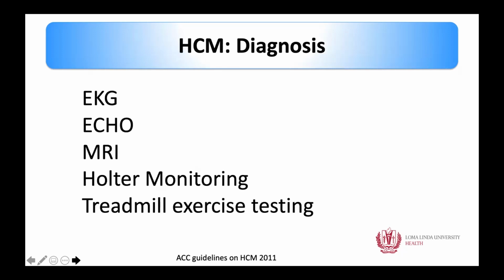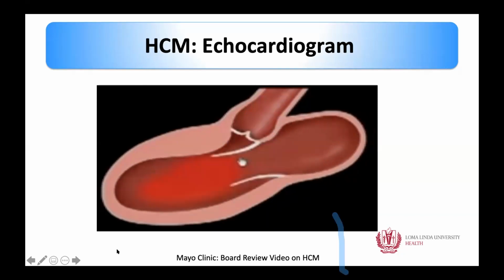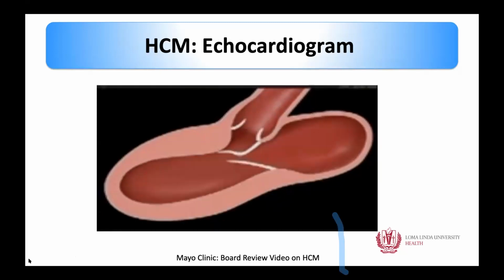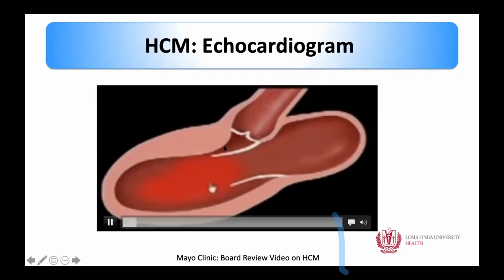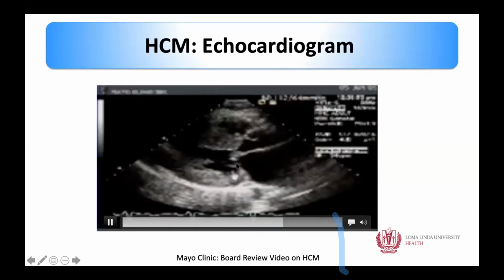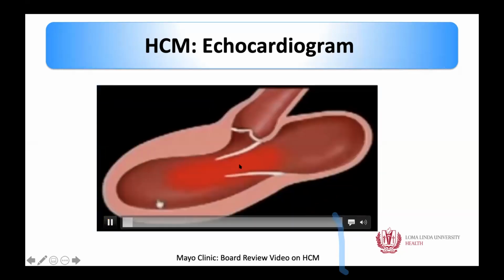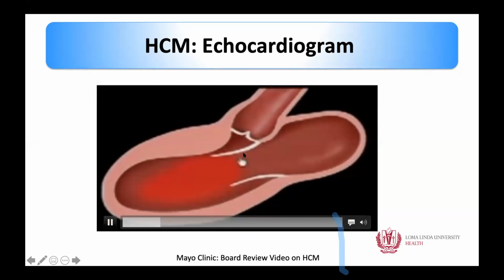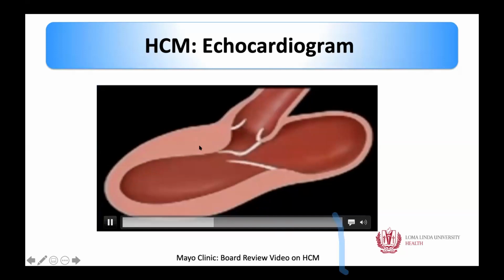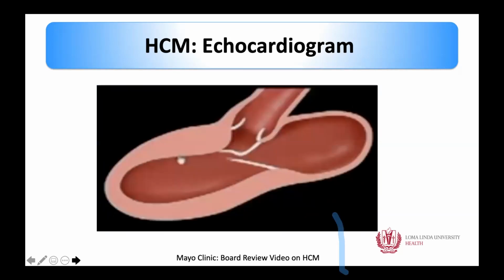Of course, we utilize many tools to make the diagnosis, but today we are going to focus on the echo findings. So let's talk about obstructive HCM. There is this Venturi effect in the LVOT that causes the LVOT obstruction because of the SAM. And whenever SAM happens, in 20% of the patients there is mitral regurgitation because of SAM, and that mitral regurgitation typically is posteriorly directed. We'll speak about mitral regurgitation in HCM, but remember that whenever the mitral regurgitation is happening because of SAM, it's posteriorly directed, although there can be other reasons for having MR in HCM patients.